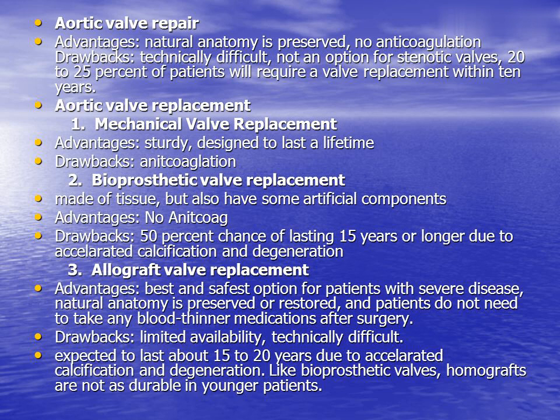2. Bioprosthetic valve replacement. Made of tissue, but also have some artificial components. Advantages: no anticoagulation. Drawbacks: 50% chance of lasting 15 years or longer due to accelerated calcification and degeneration.